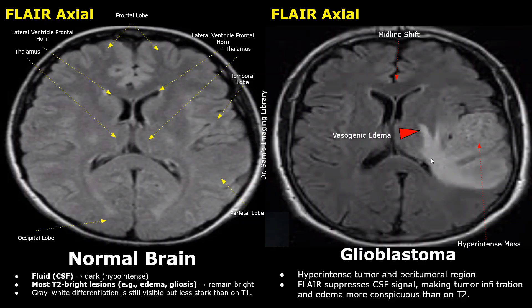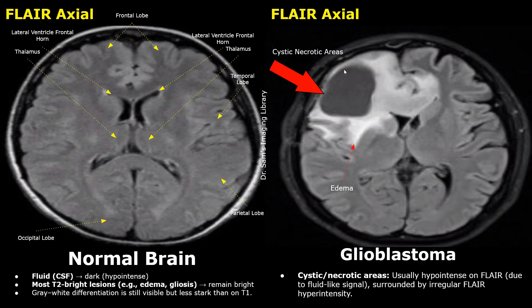This mass has a more cystic appearance than the previous cases, which is why it appears hypo-intense. It consists of more free fluid-like or CSF-like components, which led to its dark appearance on this FLAIR image. The edema appears hyper-intense and surrounds the mass. Mass effect and midline shift are present.